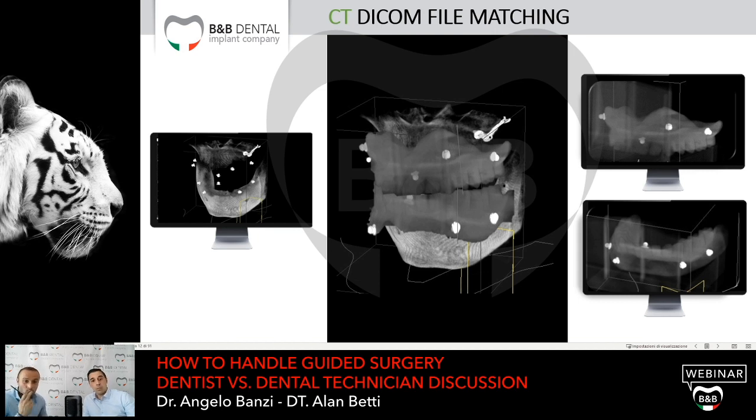That's why, when a patient comes to your clinic and you are going to use his prosthesis as a radiological template, it's very important to always rebase it, because we need the perfect impression, the perfect copy in that moment of the soft tissues. An important thing for rebasing the prosthesis: don't use any type of silicone. Okay, why?